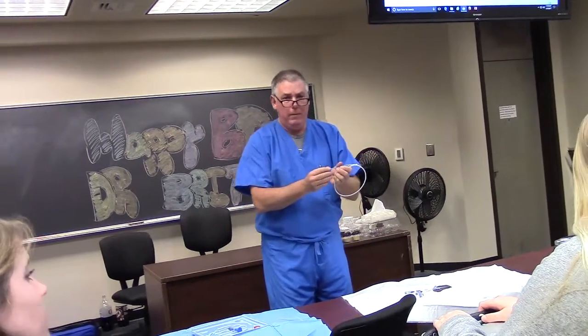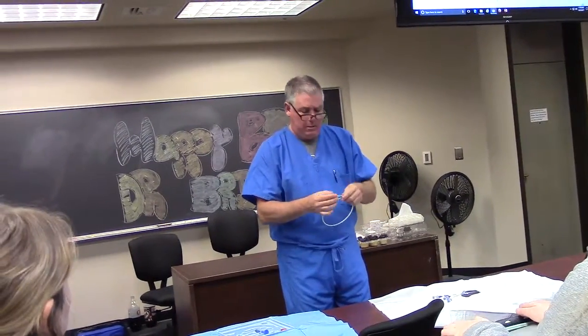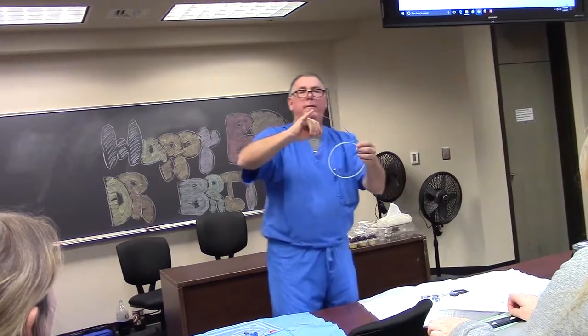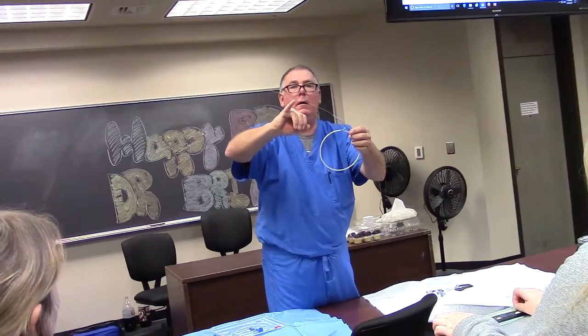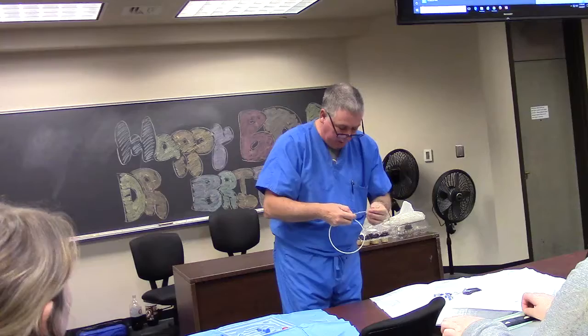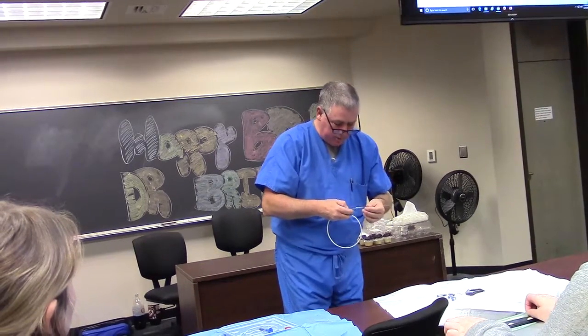Okay? How do you see the marking on the J-wire since it's in the needle and the needle's in the body? No, you're looking for that right there. Yeah, but isn't that in the body already? As it comes out, as it passes by you. Oh, that's the marker right there.